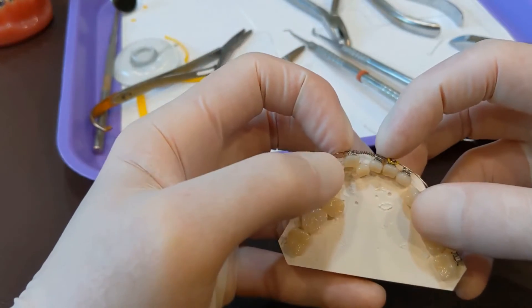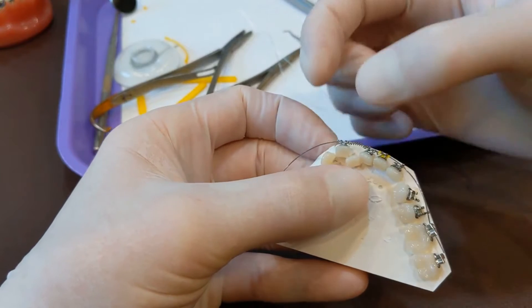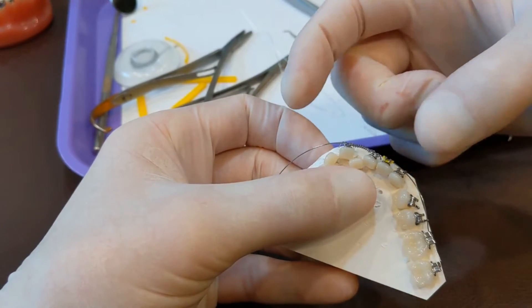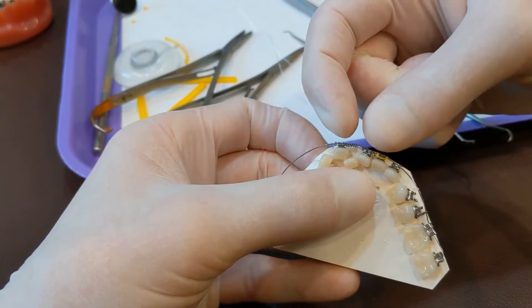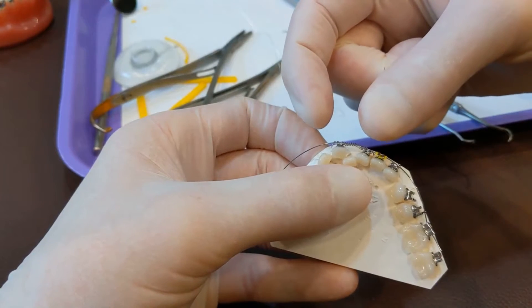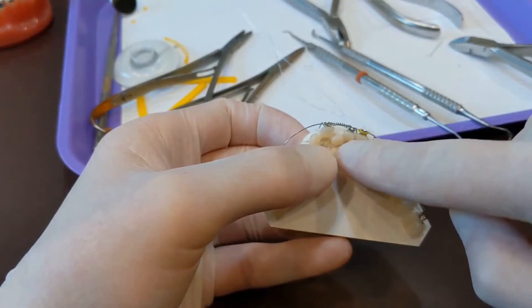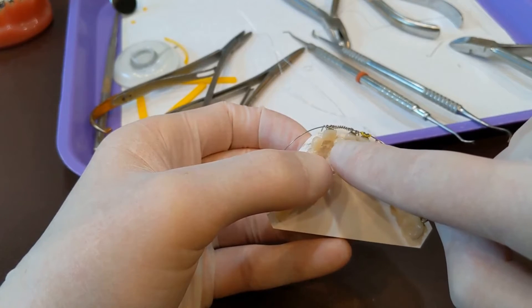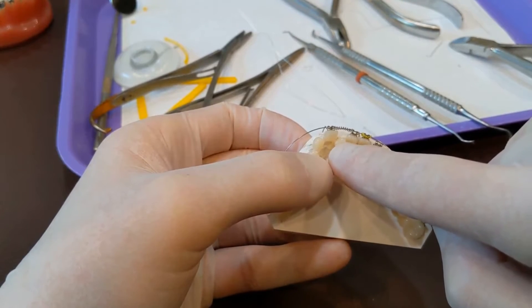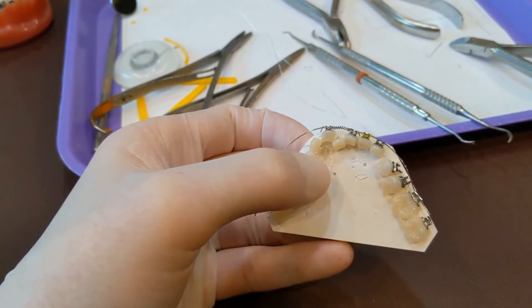Between now and next time, this is going to push back open until it's passive again. Right now it was passive, then we compressed it — now it's active — and it's going to push actively until it goes back to its normal size. As it does, it'll open up space for this tooth right here. Once we have enough space for that tooth, we can get a bracket on that tooth and get it lined up. That's how you use open coil spring.